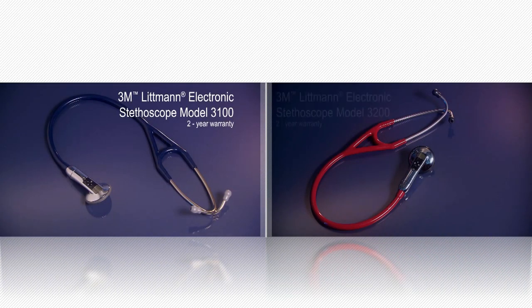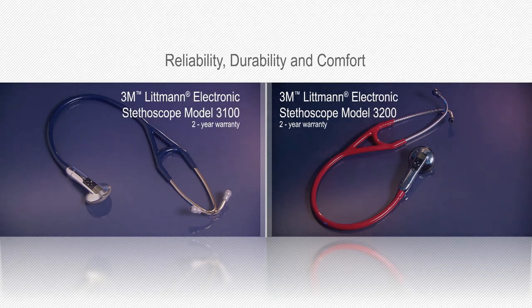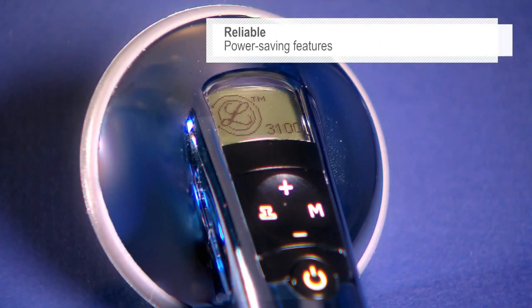The Littmann Electronic Stethoscopes are designed for superior reliability, durability and comfort. They run on one regular AA battery and offer power saving features like sleep mode and low battery alerts.